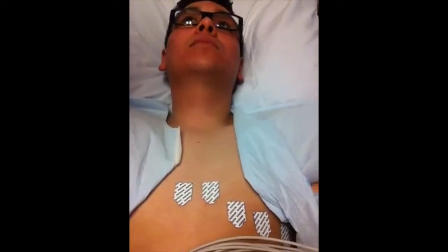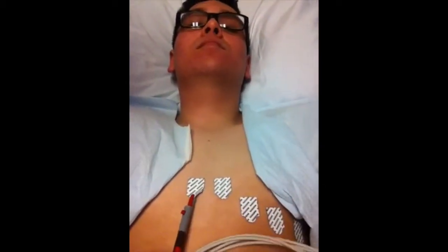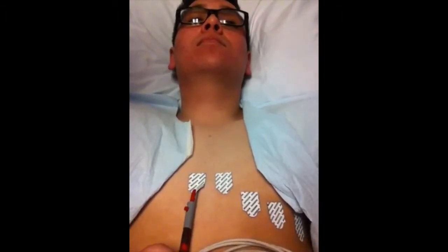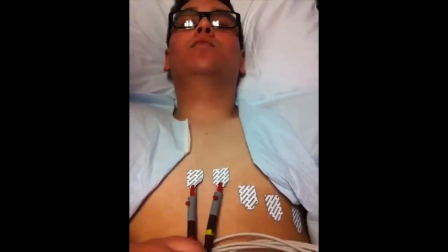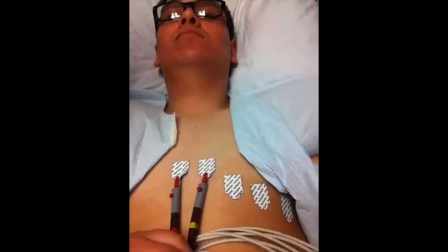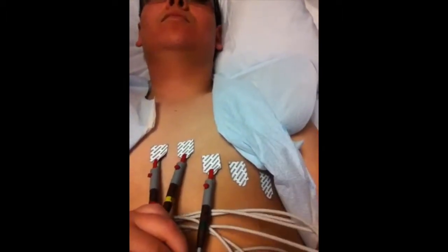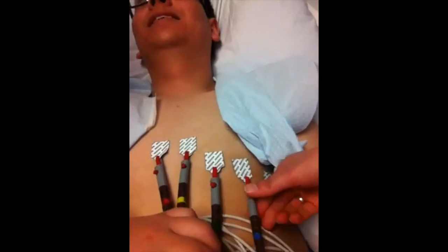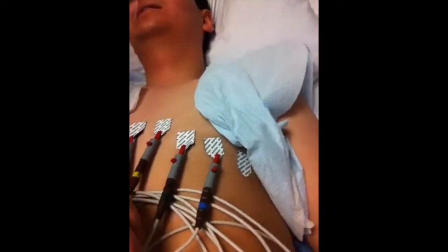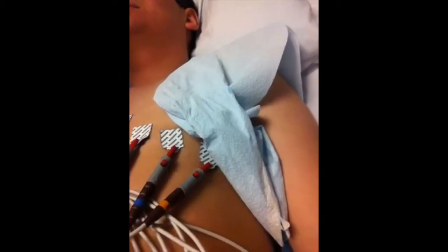After you've applied all the grounding electrodes, start working on the chest area. We start with V1 and make sure they don't peel off. V2, V3, V4, V5, and V6 is right under the armpit area.